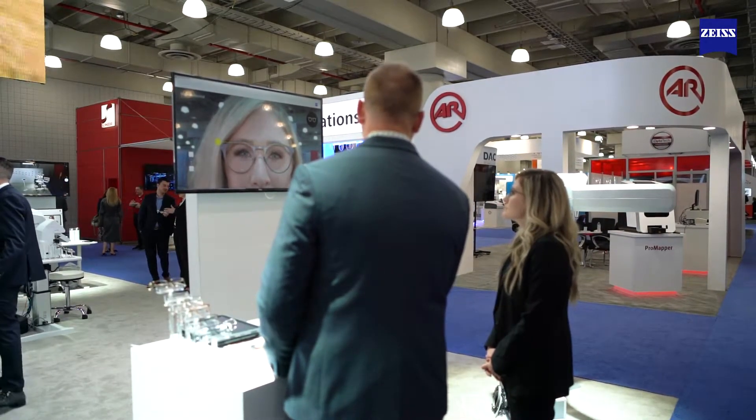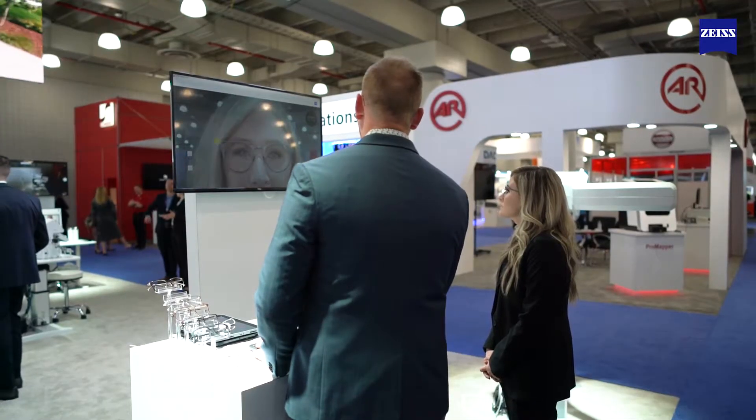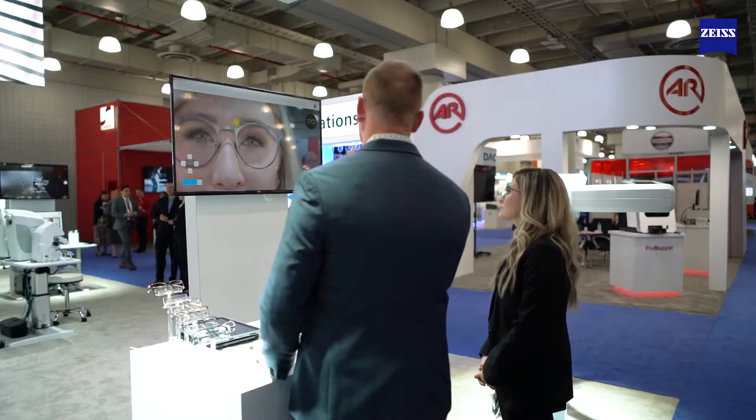They can go through here with a guide up at the top and do all of their measurements. The nice thing about the VisuFit is it's so accurate that it hits all of these measurements, so the opticians are more verifying rather than having to adjust any of the parameters.